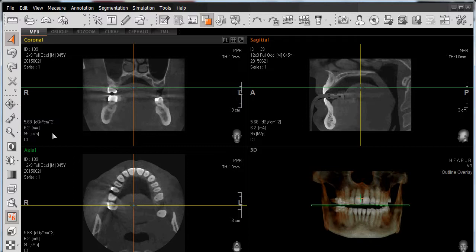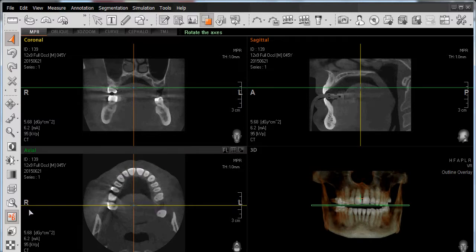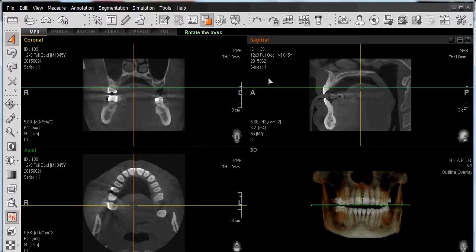The other panes, such as axial and sagittal, have a similar layout. Patient information, anatomical markers, patient orientation in the bottom right-hand corner, dosage for that particular scan, and thickness adjustment. The same applies to our sagittal pane: patient information, radiation dosage, patient orientation, anatomical markers, and thickness.